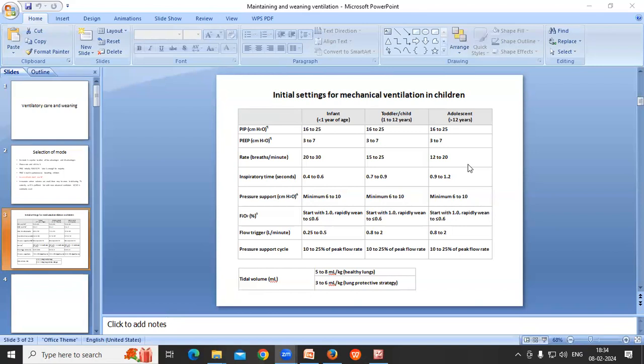You can go up to 20 also, if in PEEP titration you are able to get your compliance better at 20, saturation better at 20, with less hemodynamic effects. Even then you can keep 20. The maximum PEEP I went to is 24. We didn't have HFOV at that time. But now that I have HFOV, I'm not crossing beyond 16 or 14; I'll switch over to HFOV. But if you don't have HFOV, and the child is not maintaining saturations, and you're able to recruit the lung, you can go up to 18, 20, and even beyond that, if my criteria for PEEP titration are satisfied.